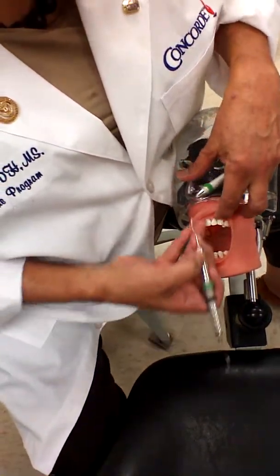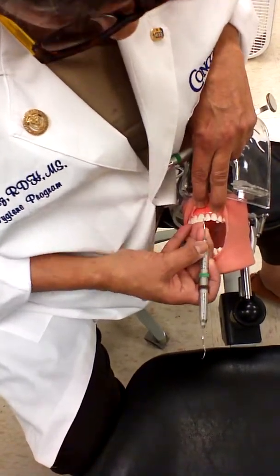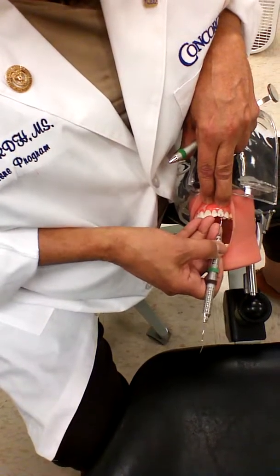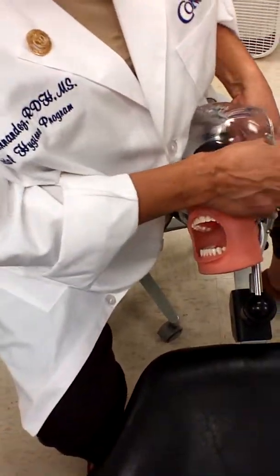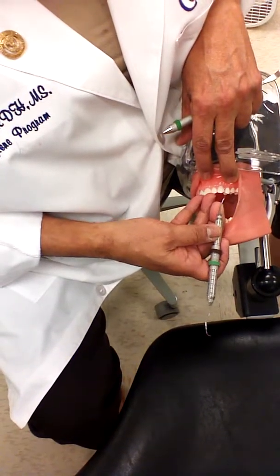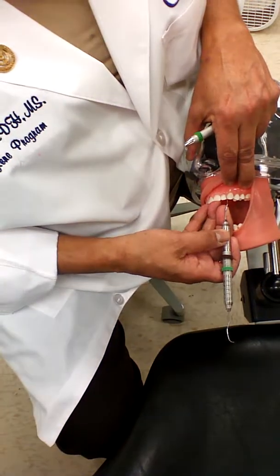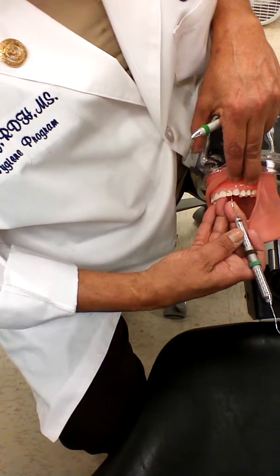Because having this thing and you moving around, I'm thinking maybe we should probably take this outer gum, because this is gum too. Maybe we should take this outer thing off here. You see my pivot. I'm going in this direction, flip my ends. Back here with number 11. At the midline. Palm open. My pivot. Slow, overlapping, deliberate strokes.